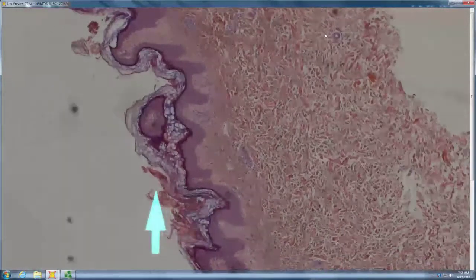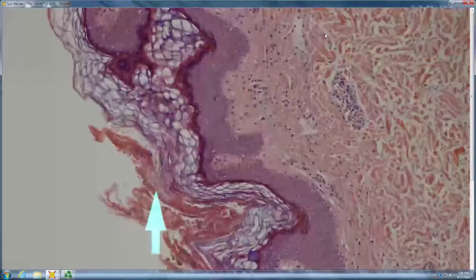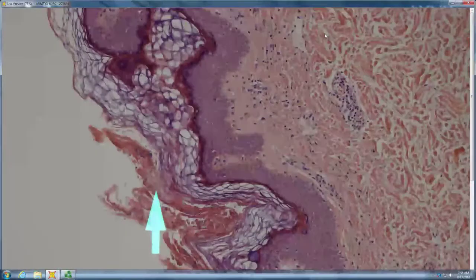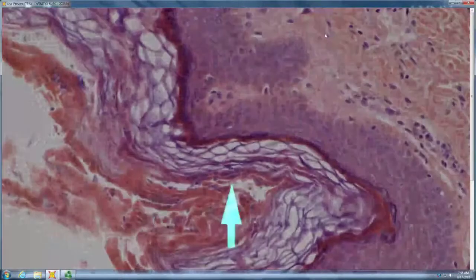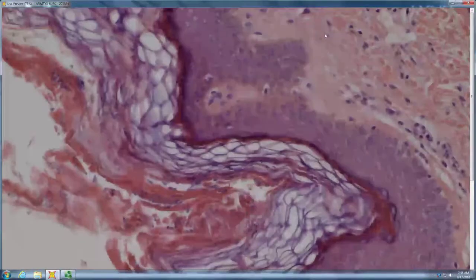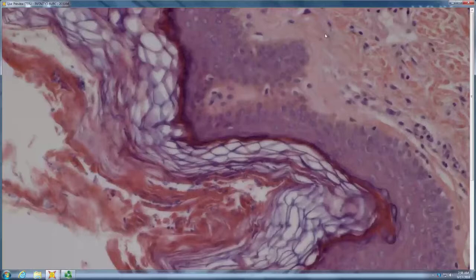Orthokeratosis. A bit papillomatous. Normal amount of fungus and keratin, a little bit hyperkeratotic. There's blue structures there. Oh, I see a yeast form. Oh, there's some of the hyphae forms. They look more horizontal.